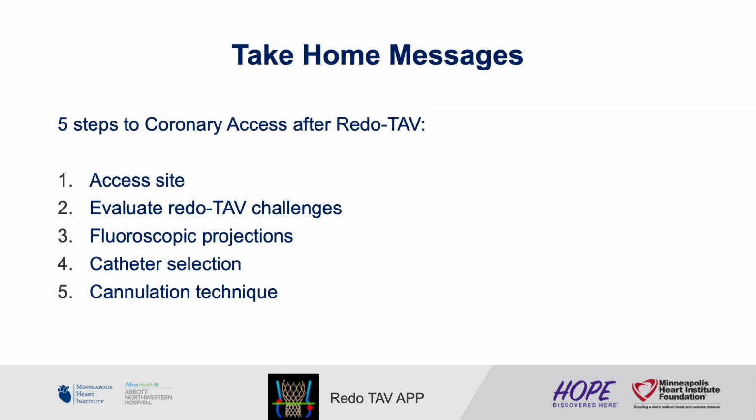Finally, for the take-home messages, here are the 5 steps to consider for coronary access after redo TAV.